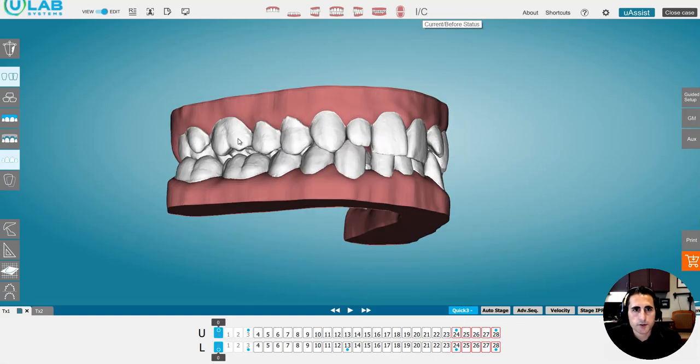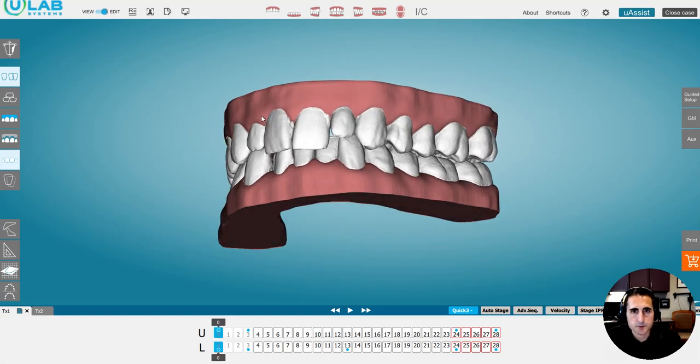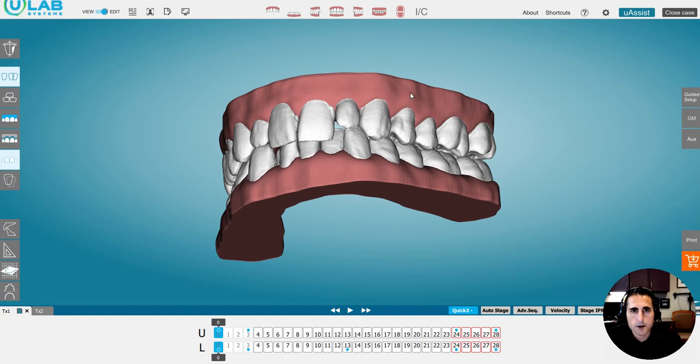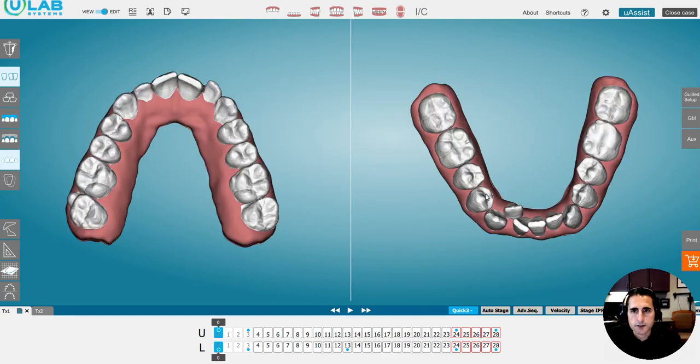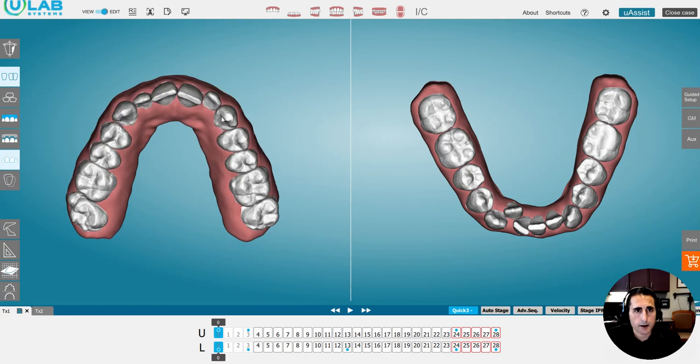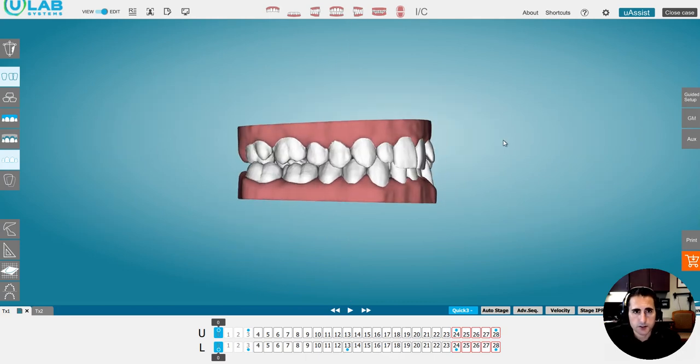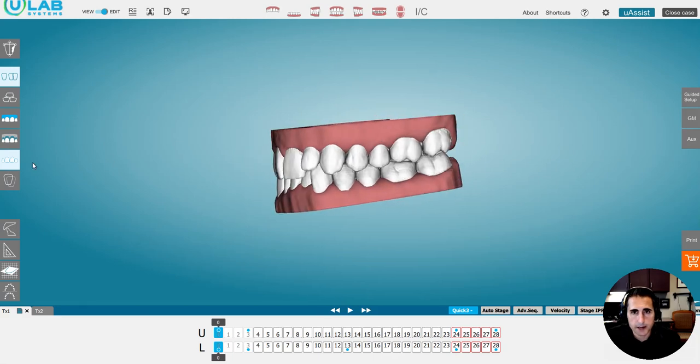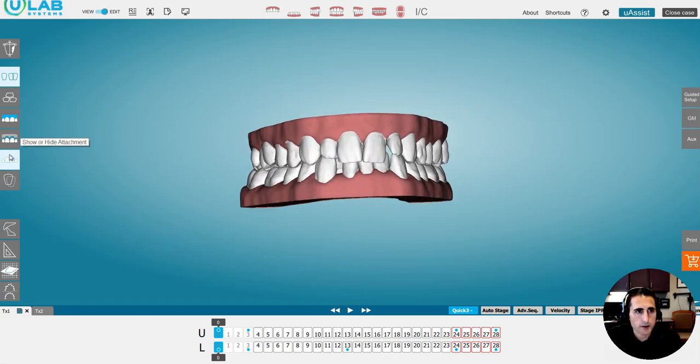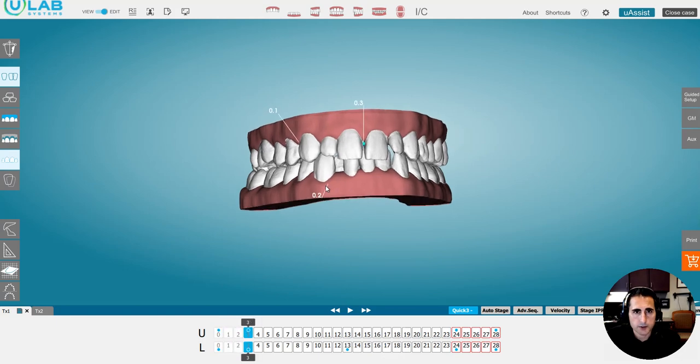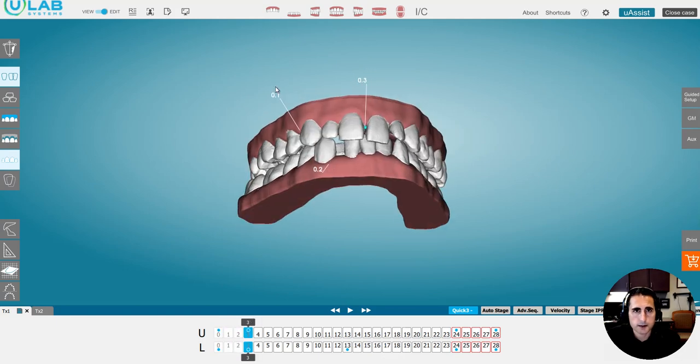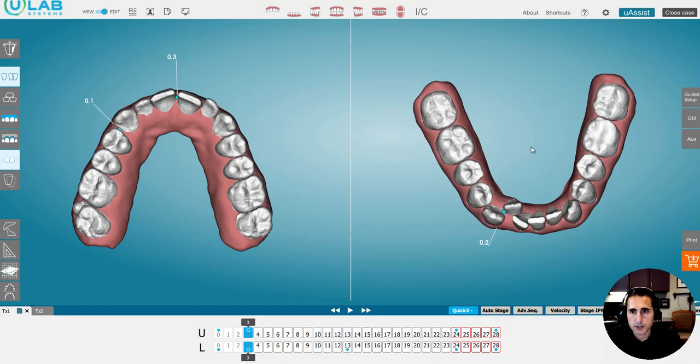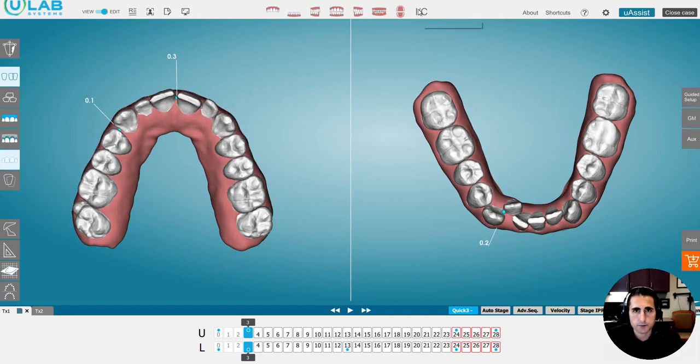So this is where this patient came in and they had some small laterals and some crowding on the lower. You can see we needed to make some space for this lateral. This is the initial plan and we also planned on bonding the laterals, so we're going to move the gingival margin so we can bond them. You can see we have a crossbite here in the posterior. On the initial plan, we added some attachments and there's the quick three.